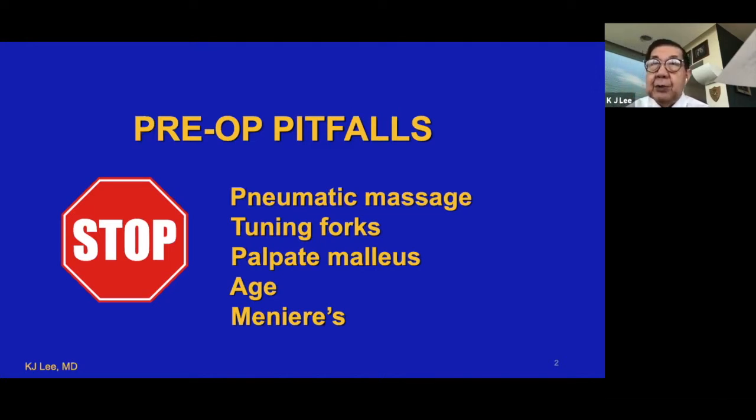the famous House Ear Institute, also have malleus fixation. So if a patient has otosclerosis plus malleus fixation, and you did not recognize it, and you did not fix it, you could have done a perfect stapedectomy, and yet the patient would have a residual conductive hearing loss.